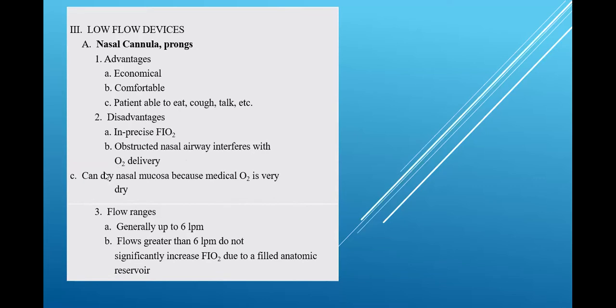Now let's look at C. It can dry the nasal mucosa because medical oxygen is very, very dry. Medical oxygen is extremely dry. So it can dry his nasal mucosa out. It can make his nose become dry, cracked, bleeding, right? Anytime we have a patient on a nasal cannula, we want to consider putting a little humidification with it because it is very, very dry.